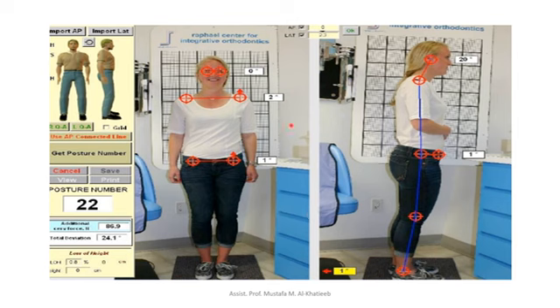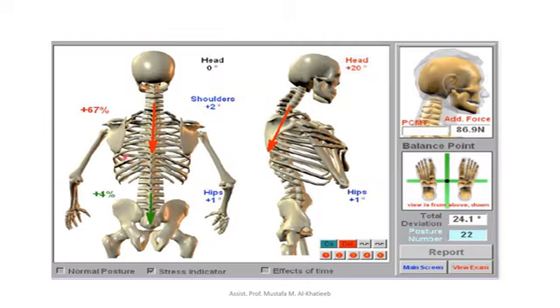After we gain the parameters of the front and lateral view by a special software, when taking the picture in a standard manner, we will get all the parameters about frontal and lateral.